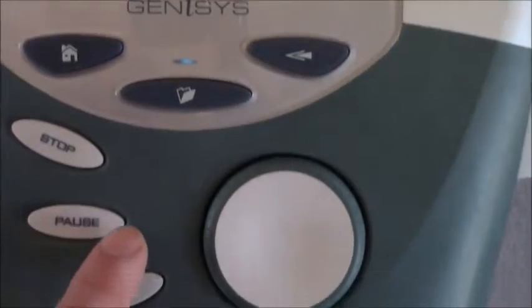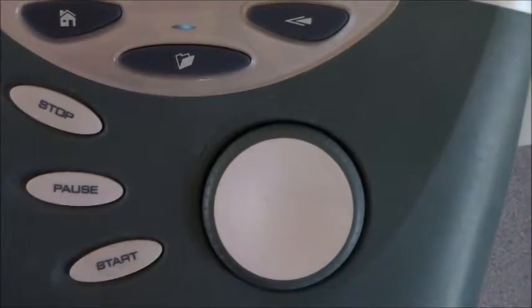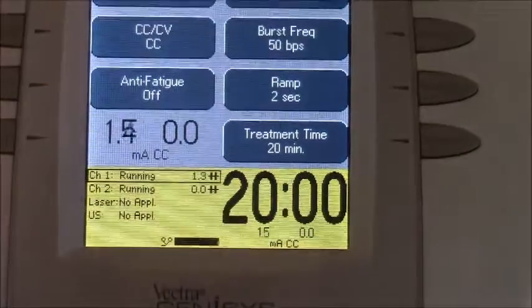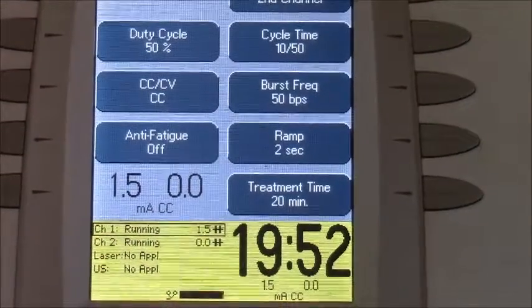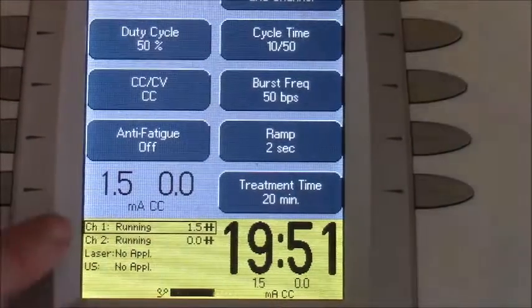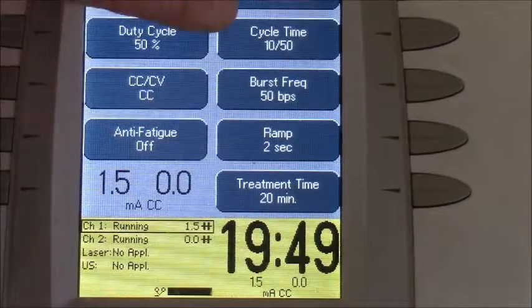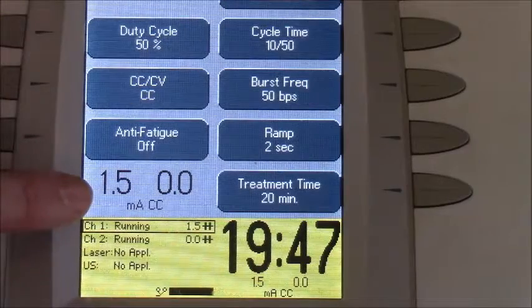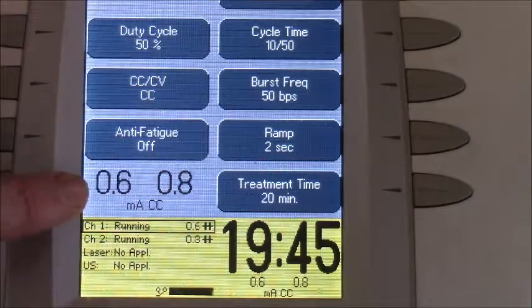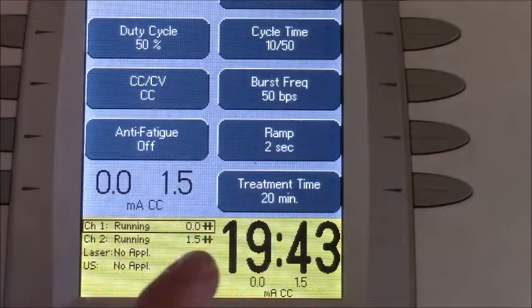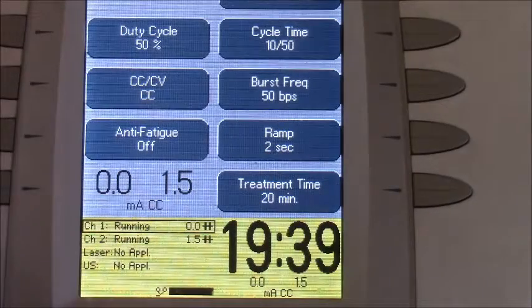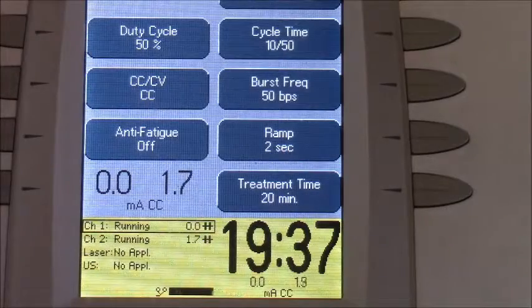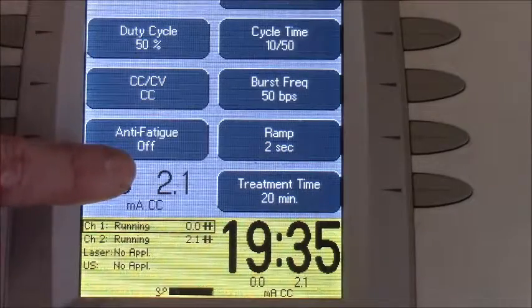Go ahead and hit the start button — that's going to initiate the treatment. You'll see that channel one is going to kick in first. I have this set to 10/50, so channel one stimulates for 10 seconds, then it transitions — there's a ramp time of two seconds — and transitions to channel two. During that time you can also adjust the intensity if needed.